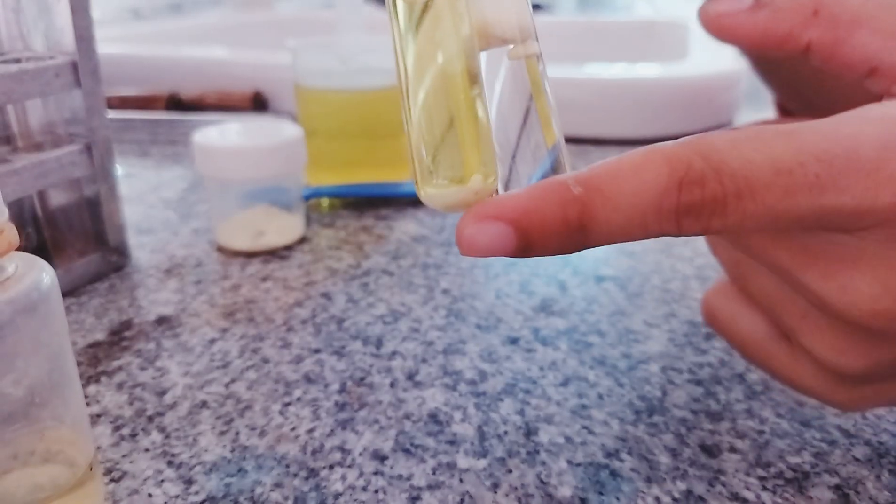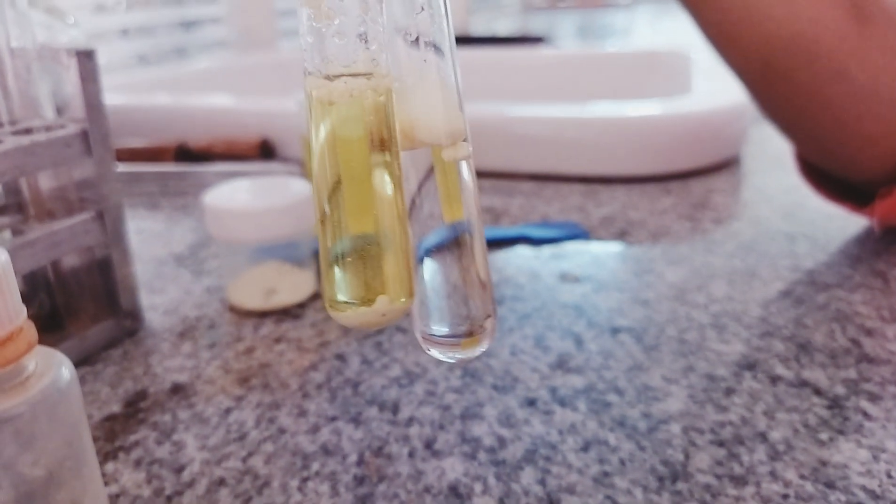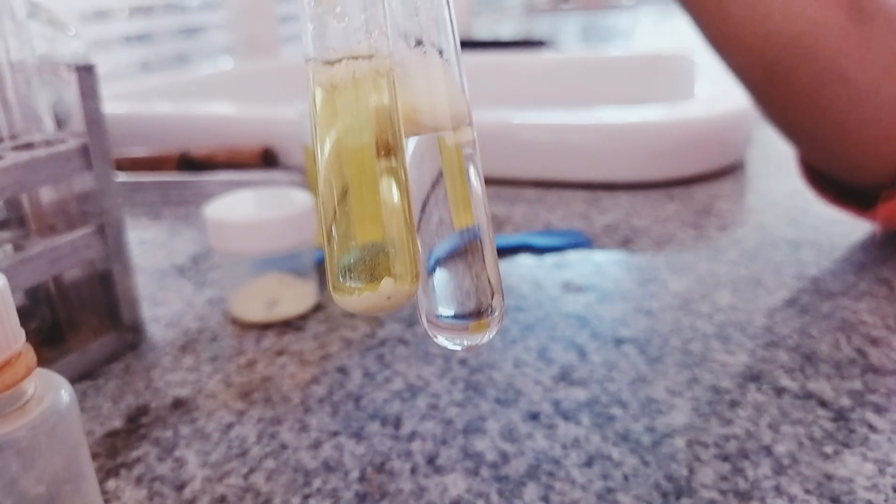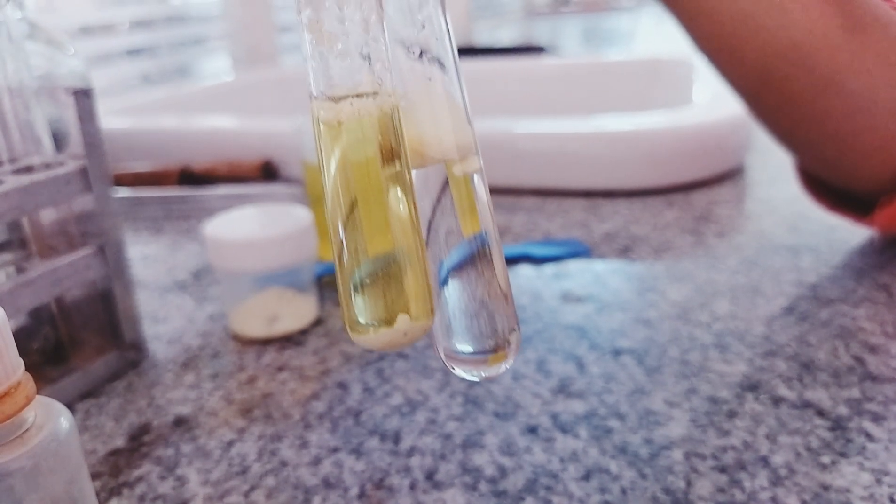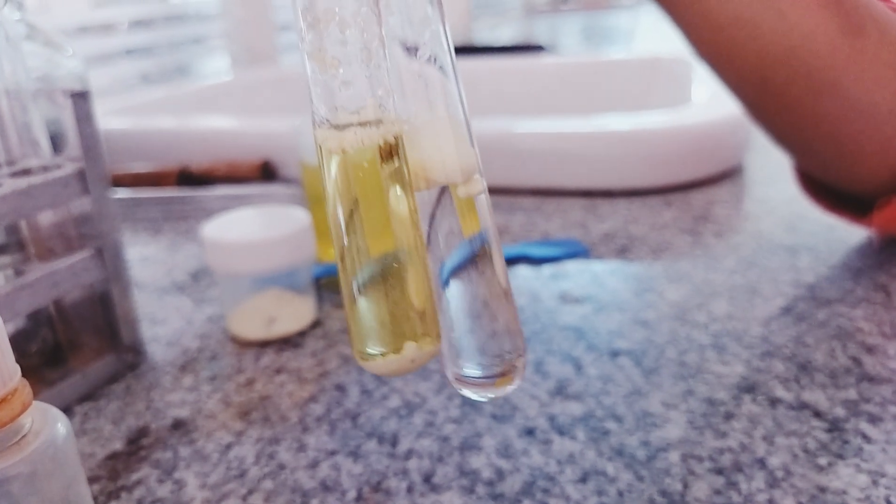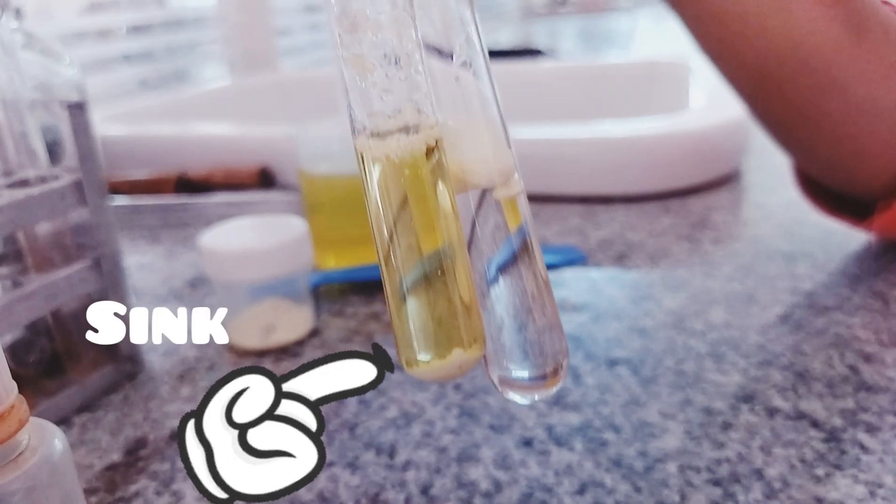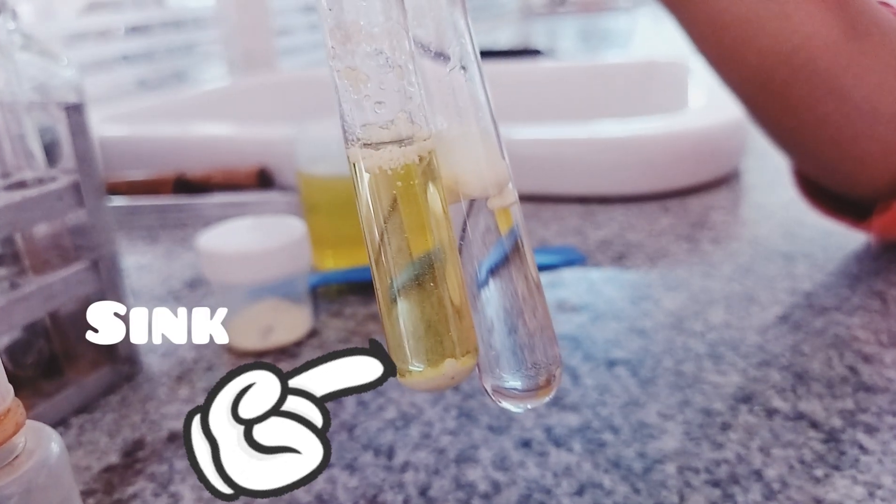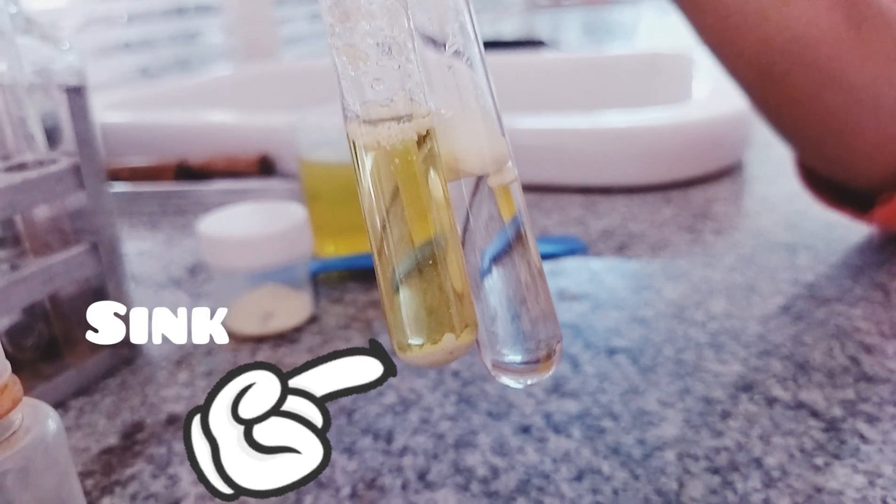The observation is, the Sulphur powder sinks to bottom in the urine sample, that is in T test tube. Whereas, in other test tube, the Sulphur powder will float.